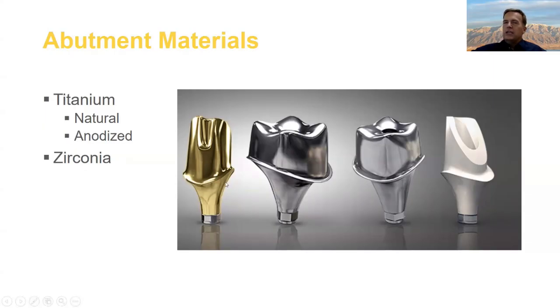And some of those treatments that we were talking about earlier, getting the tissue to stick to the abutment, are basically an anodization process that happens to make it gold as well. So you'll probably see more and more of this. It is an electroplating process that's done after the abutment is milled. Probably the nicest thing about titanium is it's a metal. So as you know, metal is malleable and tough, and it's going to give before it breaks.